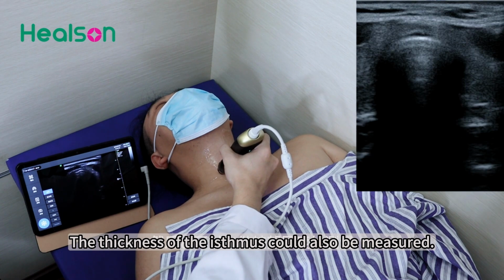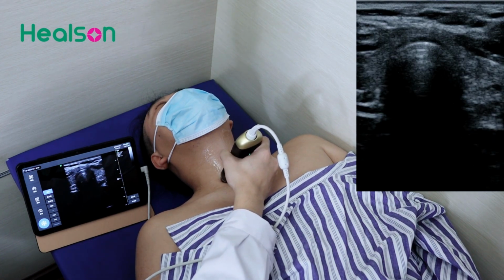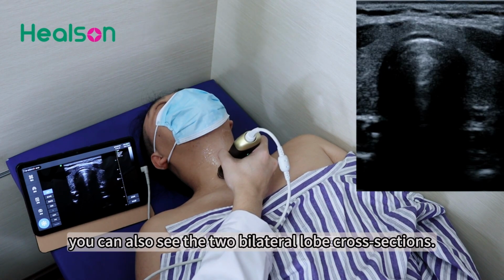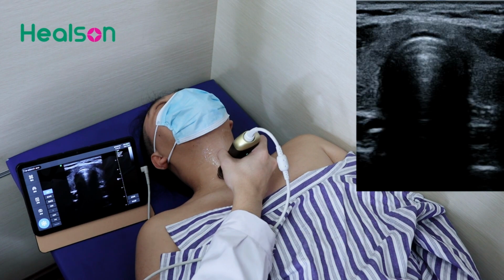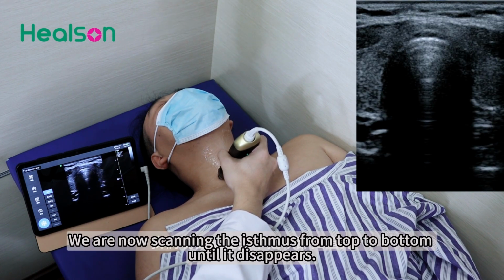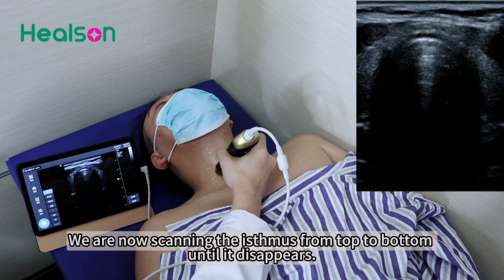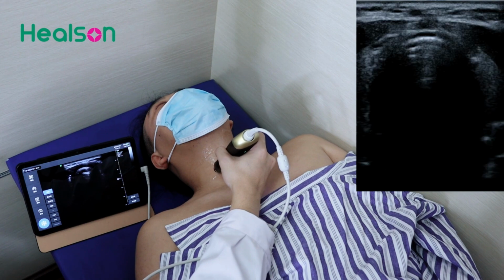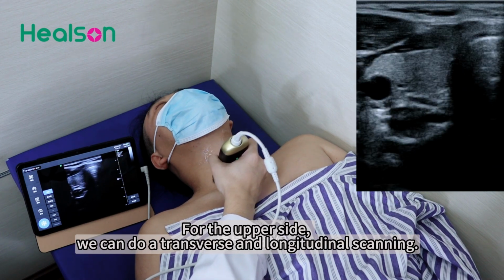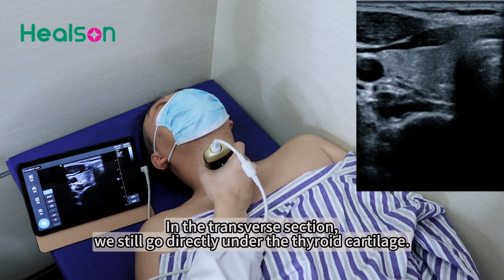The thickness of the isthmus could also be measured. At the same time, you can also see the two bilateral lobe cross sections. We are now scanning the isthmus from top to bottom until it disappears. For the upper side, we can do a transverse and longitudinal scanning. In the transverse section, we still go directly under the thyroid cartilage.